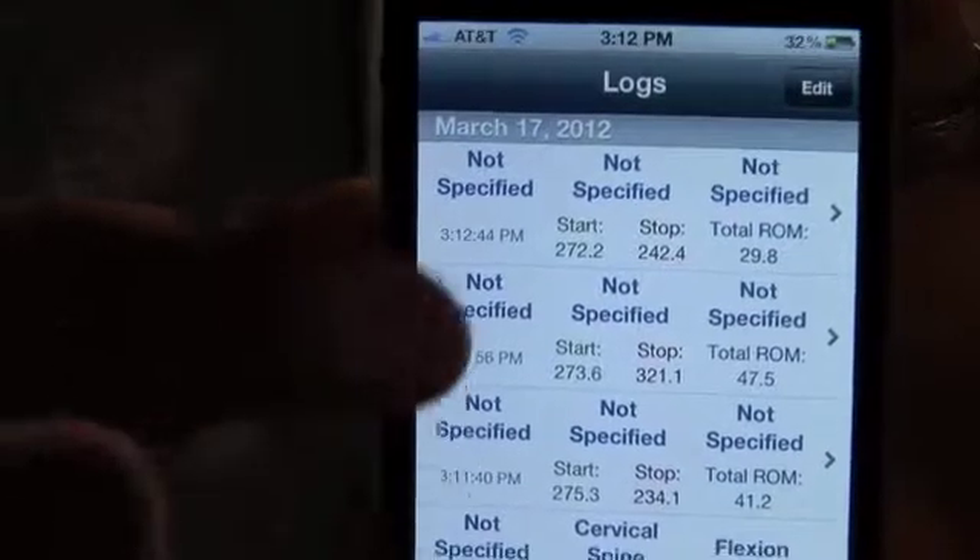Next, hit the log button. Select the measurement that was just taken.